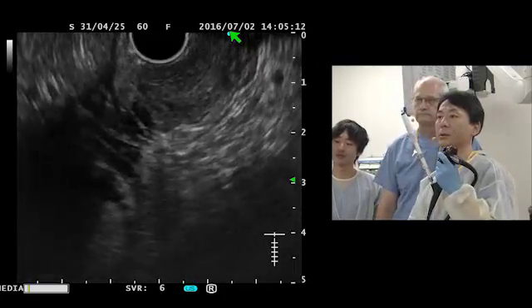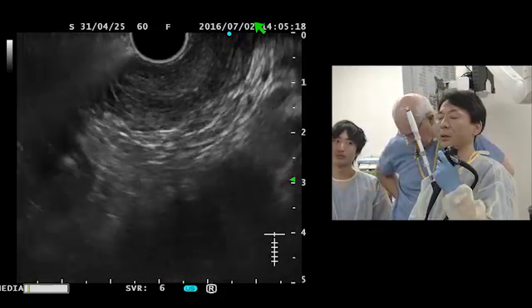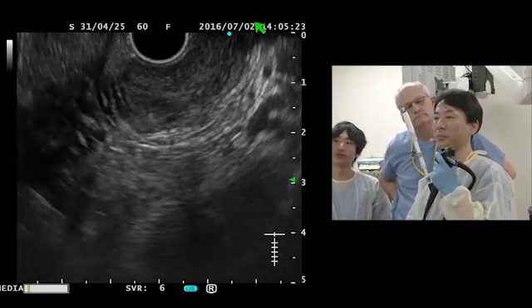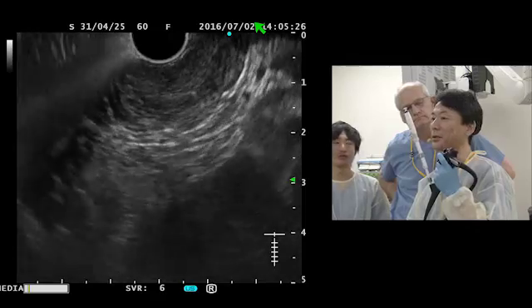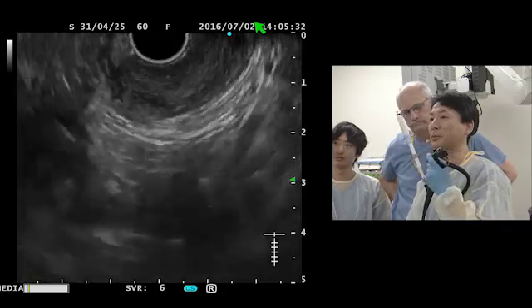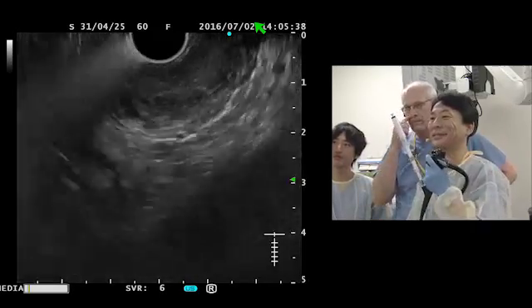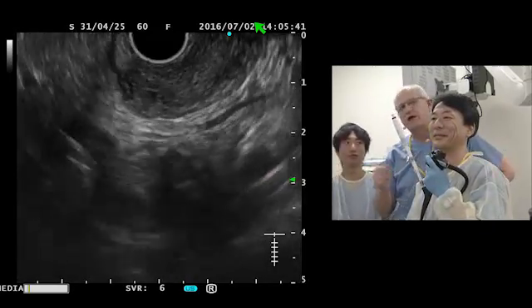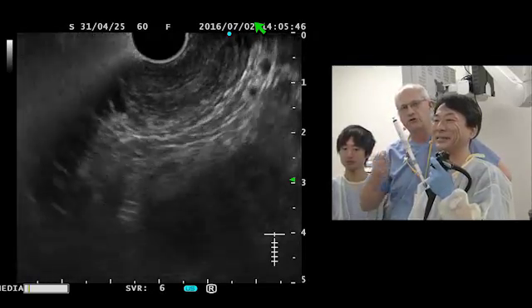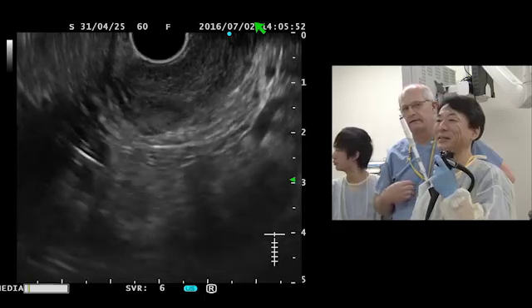Dr. Ryouzawa, excuse me, may I ask a question? Why did you choose a needle without a side port for this case? Personally, I don't think the side hole is useful to get more specimens. This is my personal opinion. In my opinion, the data is not robust enough for the side port to show that it makes a difference. Maybe it does, but we need more data.